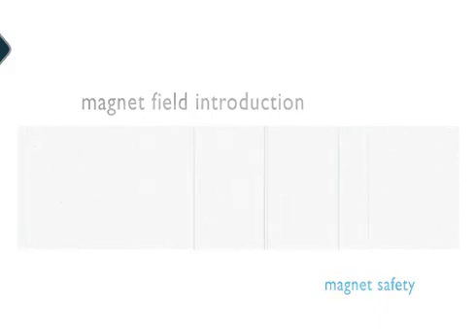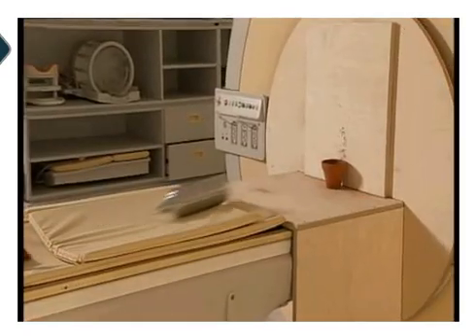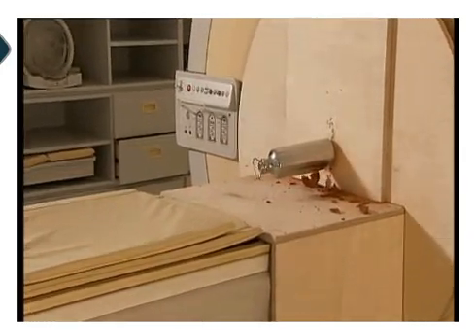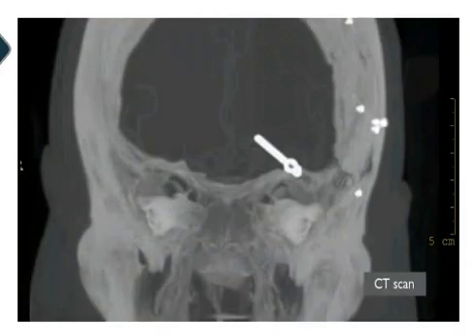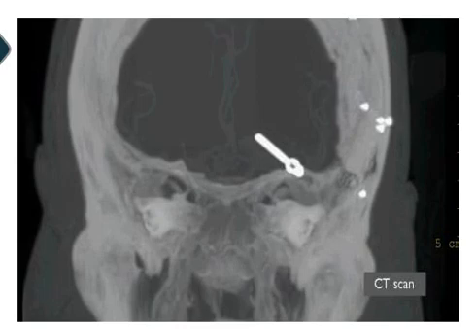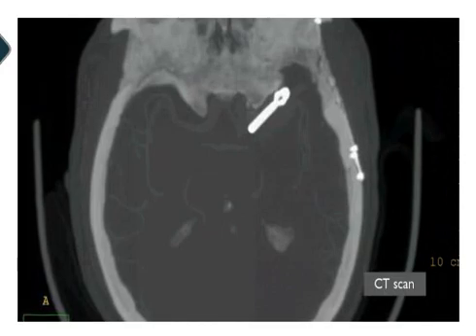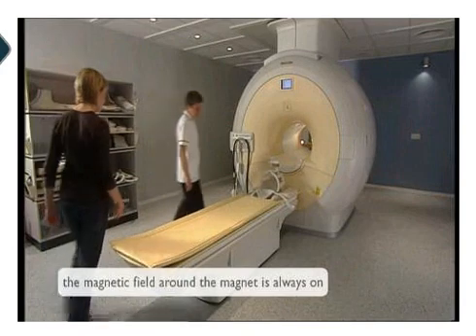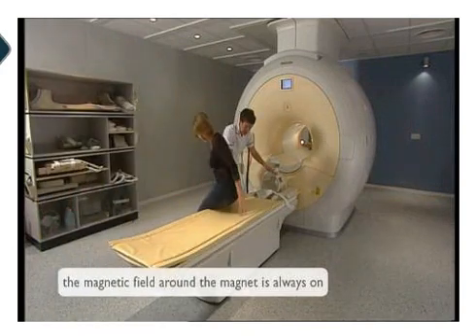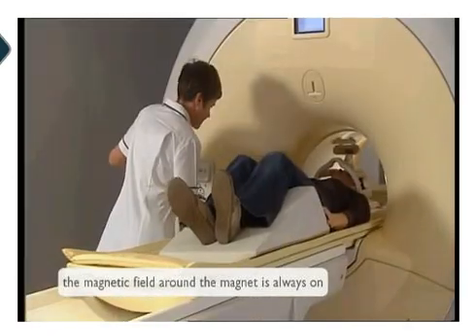Magnet field introduction. The magnetic field will attract objects made of steel or other ferromagnetic materials with enormous force. Even heavy objects can fly into the magnet. The magnetic field can also create torque forces on ferromagnetic objects, such as some implants, which may cause tissue damage. Although it cannot be seen or felt directly, the magnetic field of an MR system with a superconducting magnet is always on and must always be treated with respect.